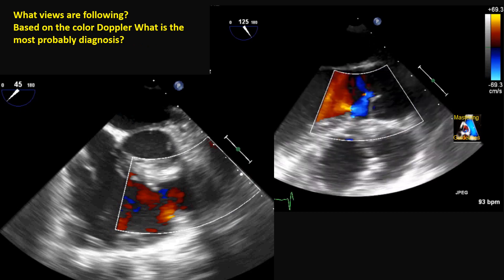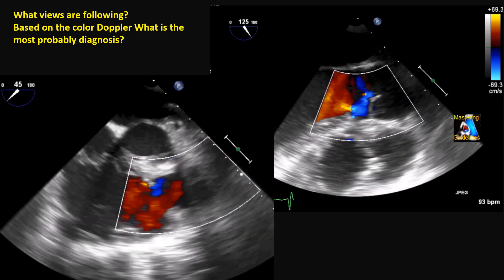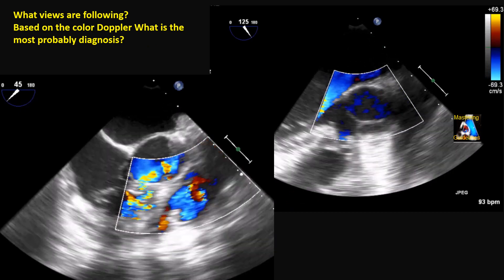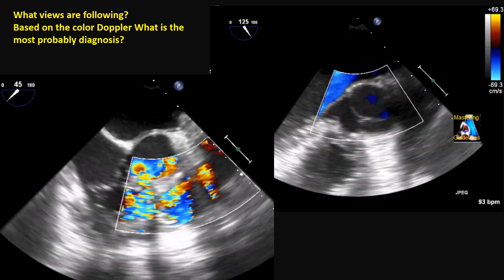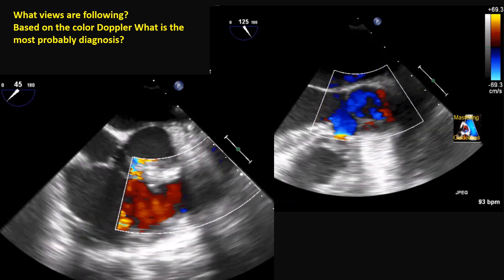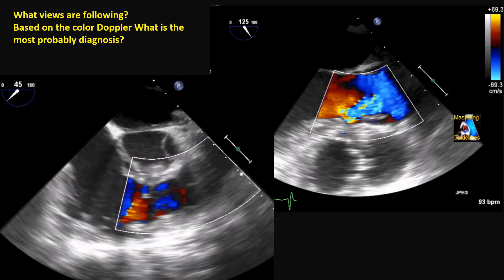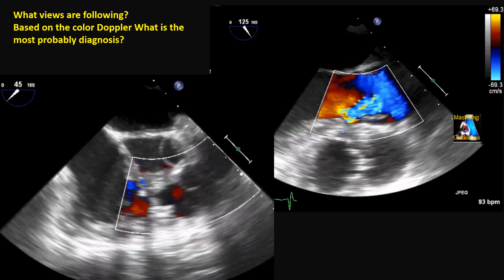Here we have two views. Name them. Do you see any abnormal color Doppler? If yes, what is the most probable diagnosis?